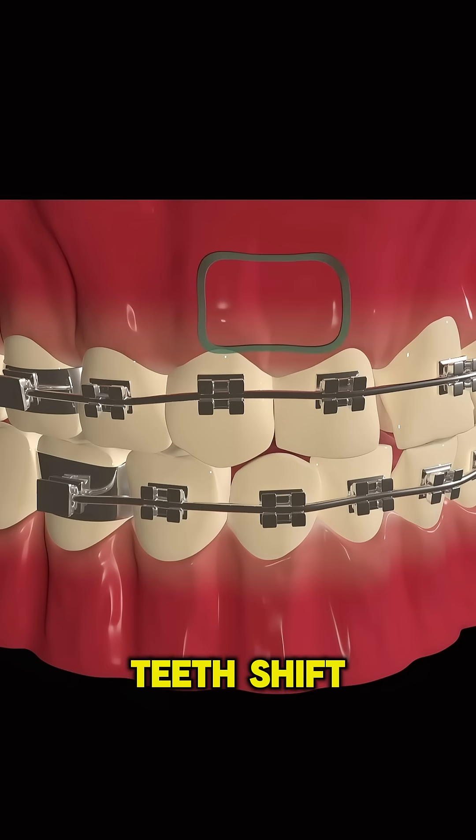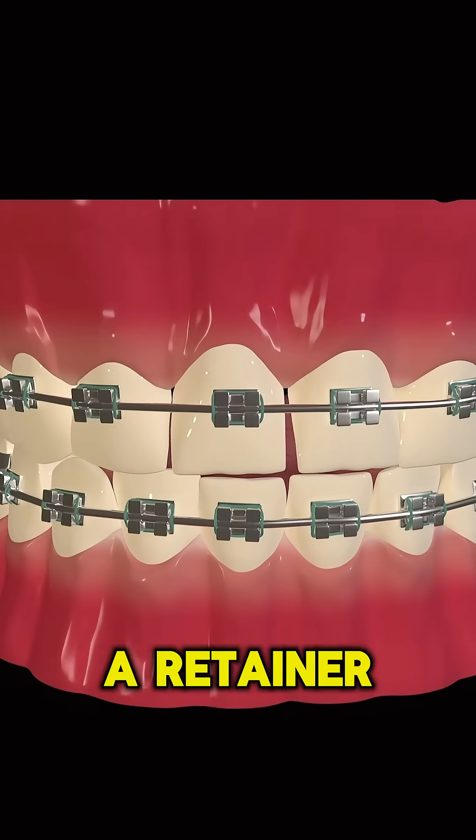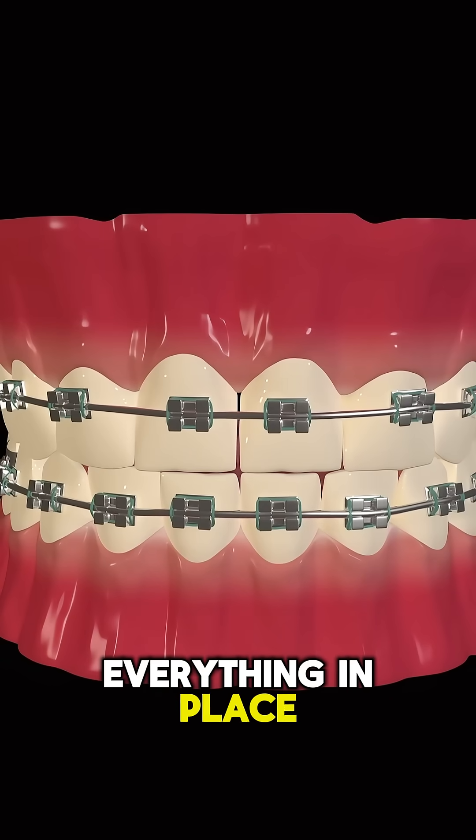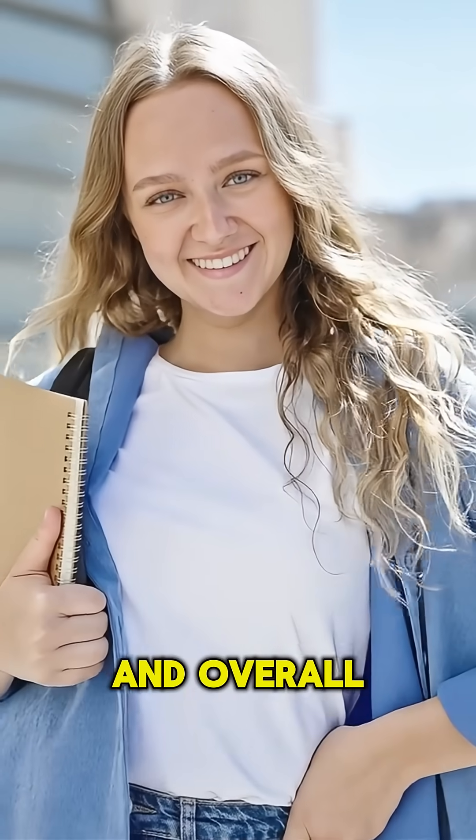Slowly but surely, the teeth shift into a straighter, healthier position. After braces come off, a retainer helps keep everything in place. Braces don't just make smiles look better — they improve chewing, speaking, and overall dental health.